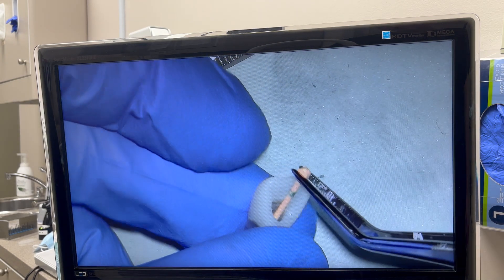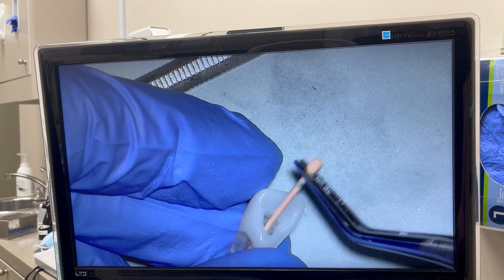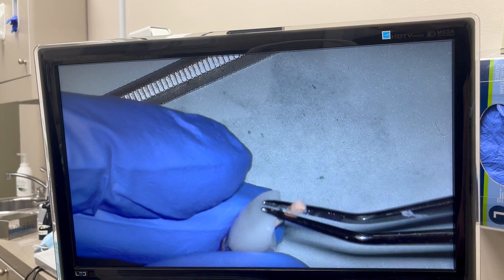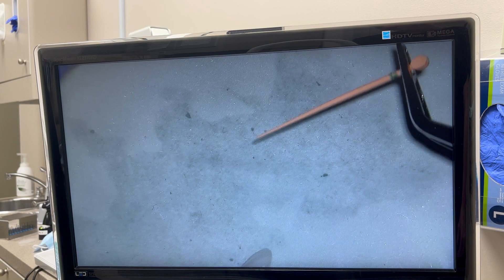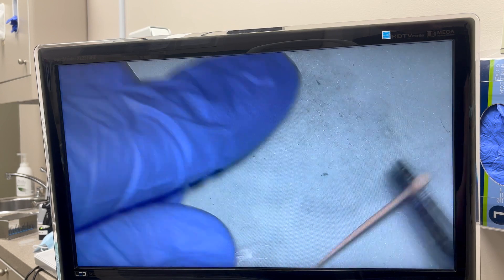Can you see the tugback here? Then I'll let go and grab it at my reference point. Now I'll measure the length. So here I have about 26 millimeters for my reference point, which means my gutta percha is sticking out about 2 millimeters outside the apex.